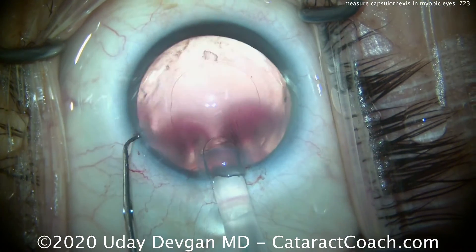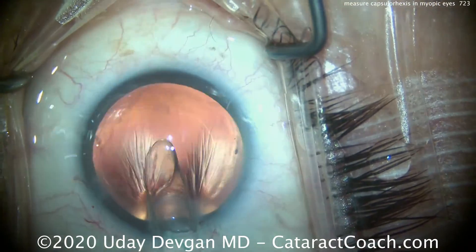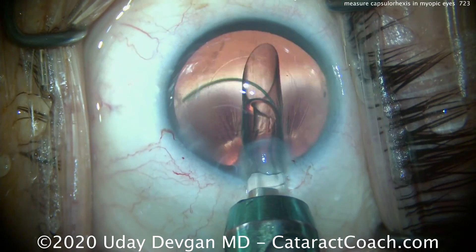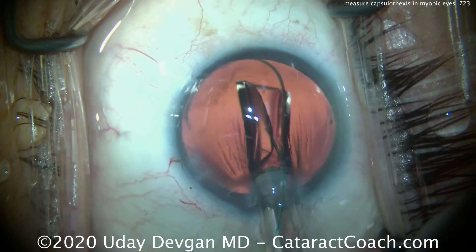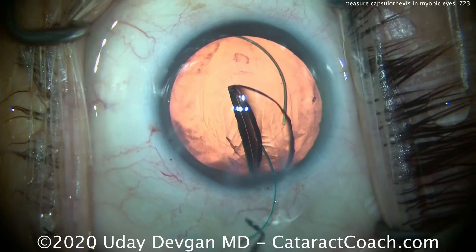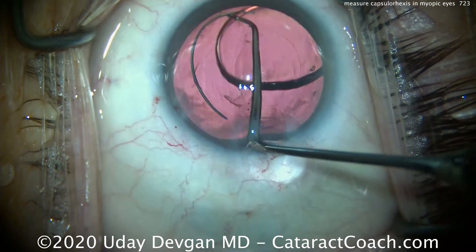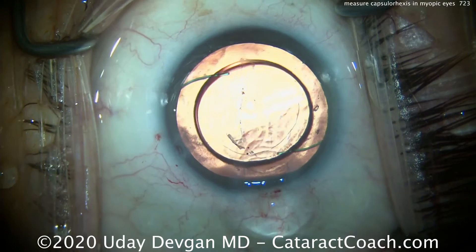Here's the three-piece lens going into the eye. Remember, it can twist in the injector, so let's make sure it goes in appropriately. The leading haptic should come out in the orientation of the number 7 — in my mind, I'm thinking 7. Let me see it look like a 7. That's correct, and that will go inside the capsular bag in good position. We're taking our time to deliver the lens slowly and very controlled. On the trailing haptic, we can dial it into the capsular bag — it should look like the capital letter L. So 7 and L. The eye as a whole has an optic that looks like a reverse S, not the letter S — S is for a stupid mistake, and I don't want to make a stupid mistake.